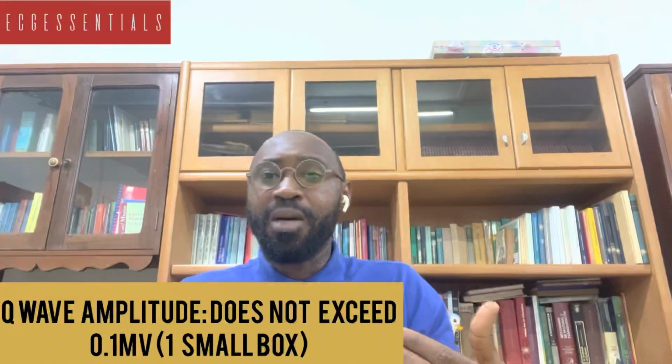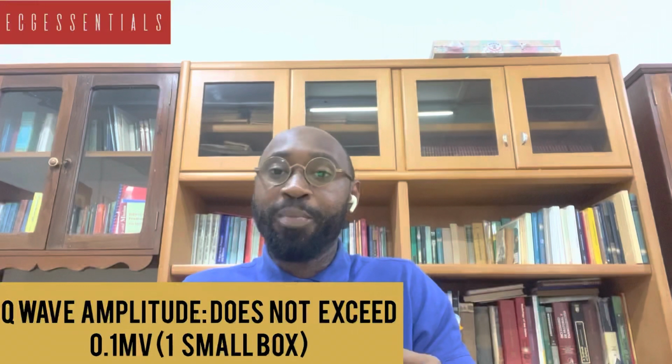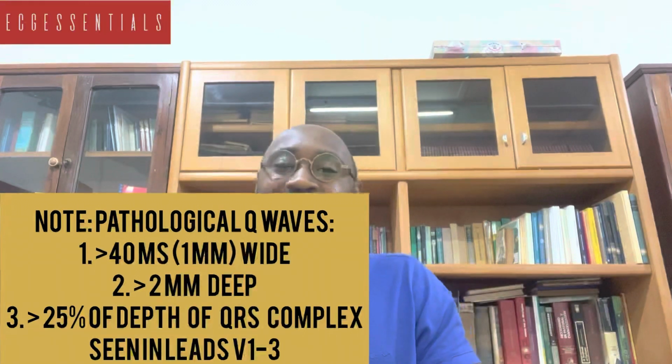When Q waves are present, let's note that generally their magnitude does not exceed 0.1 millivolt, and it's important to remember this fact so that we are able to recognize pathological Q waves when they show up. We will be discussing pathological Q waves later. Let's also bear in mind these fascicles that we have just mentioned. They will also become important when we are discussing fascicular blocks and other bundle branch blocks.